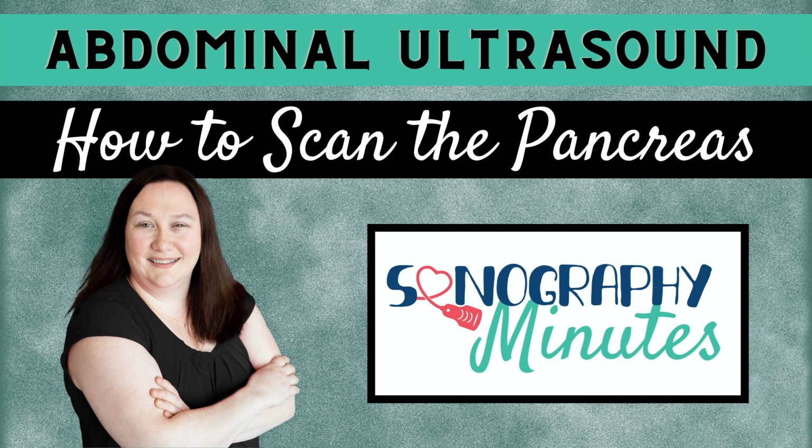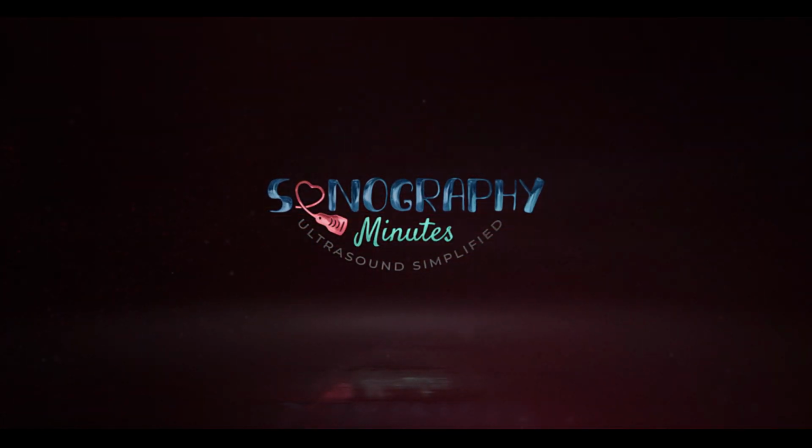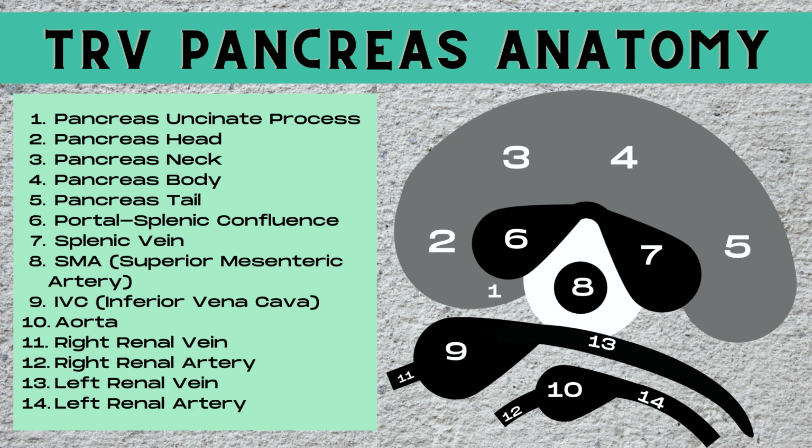Let's ultrasound! On today's edition of Abdominal Ultrasound, we're talking about the pancreas. Let's cover protocol, tips, and measurements. Let's discuss the anatomy of the pancreas.